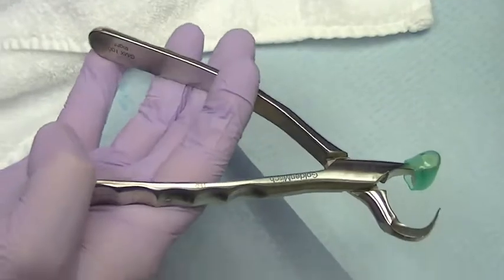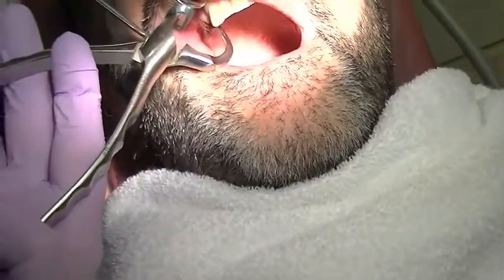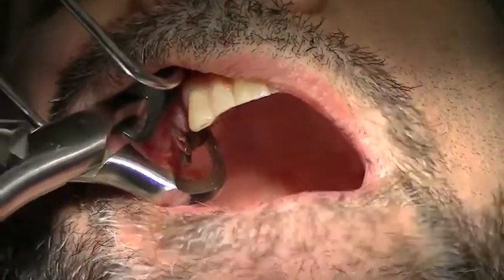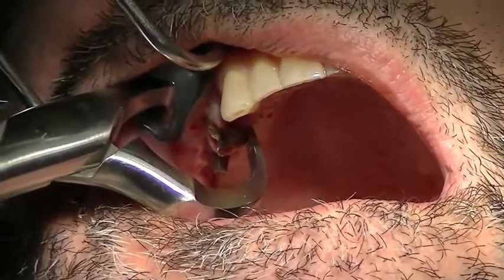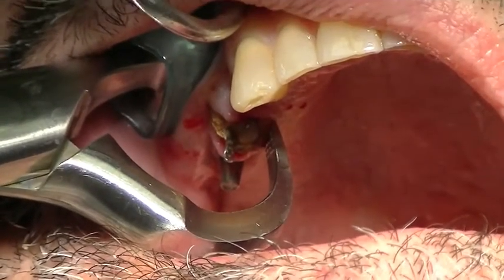We're going to remove a very badly broken down, fractured maxillary right cuspid tooth using the Innovative Physics Forcep. The forcep has two components: the beak, which will engage the lingual or palatal surface of this root — this is the working end of the instrument as it creates tension along the periodontal ligament — and the bumper, which is placed as high up the vestibule as possible.